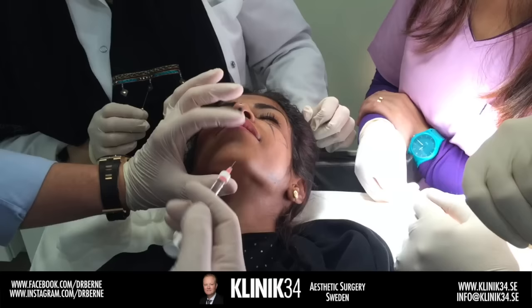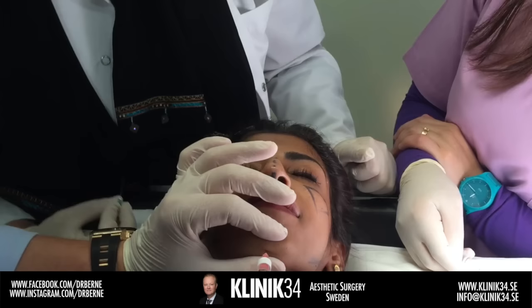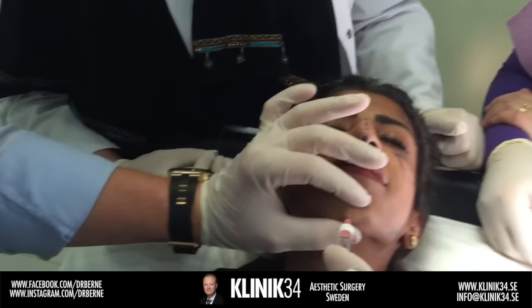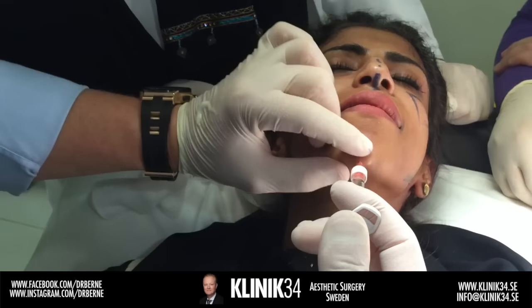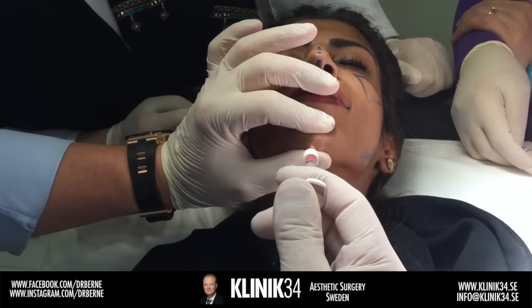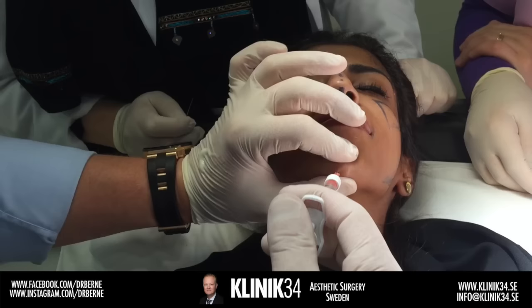We're going to combine both techniques. First we start with perpendicular — we find the midline, I'm resting on bone. You can already see that it's not contained subcutaneously yet — it's a very small, tight chin, so we have to do the combinational treatment.